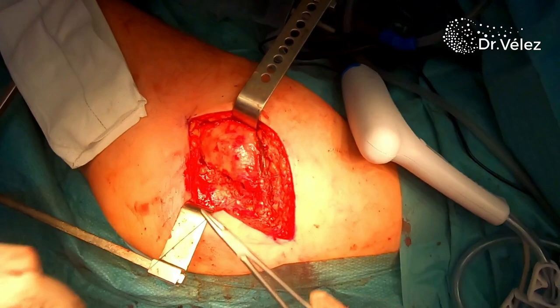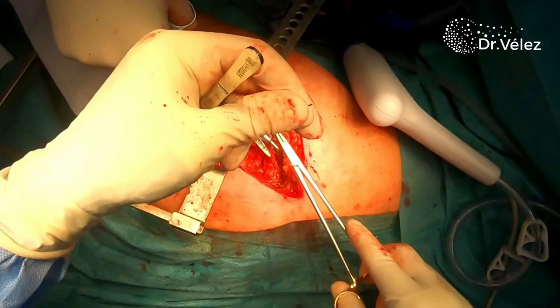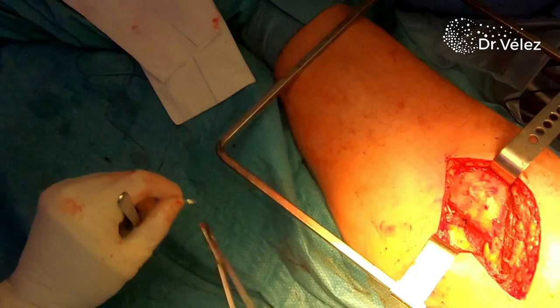We also try to do a very tight and accurate closure of the hip capsule and the external rotators. We also close the fascia and then the subcutaneous tissue progressively. And then we tend to use stitches for the skin.